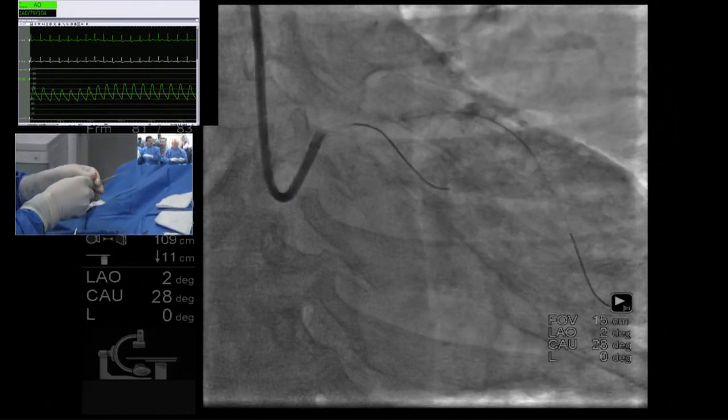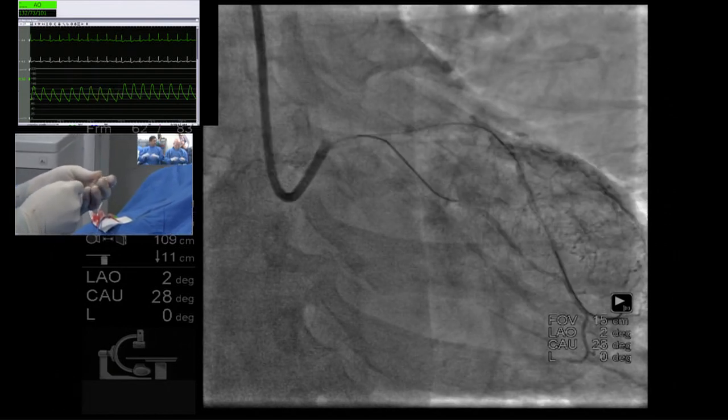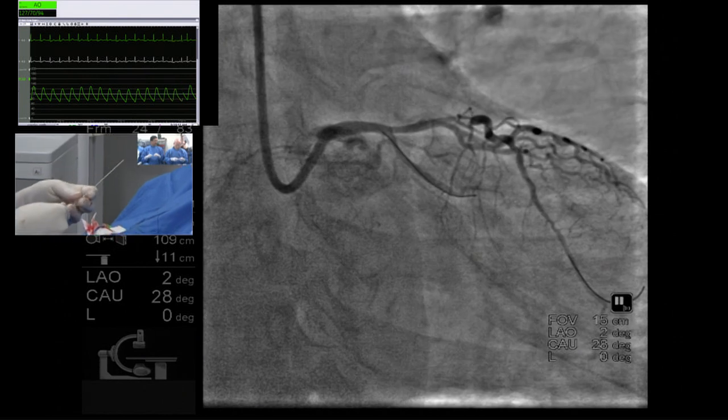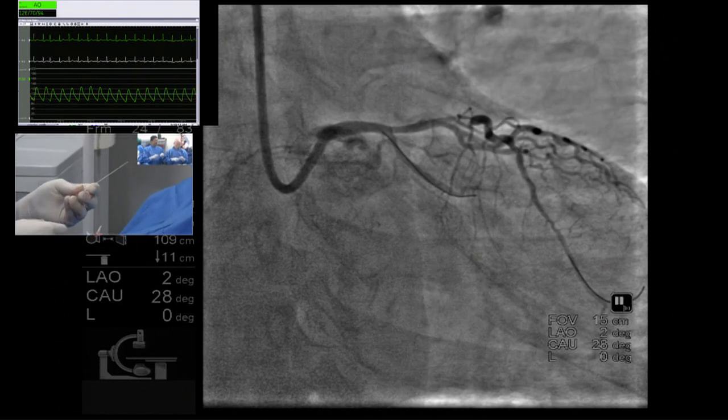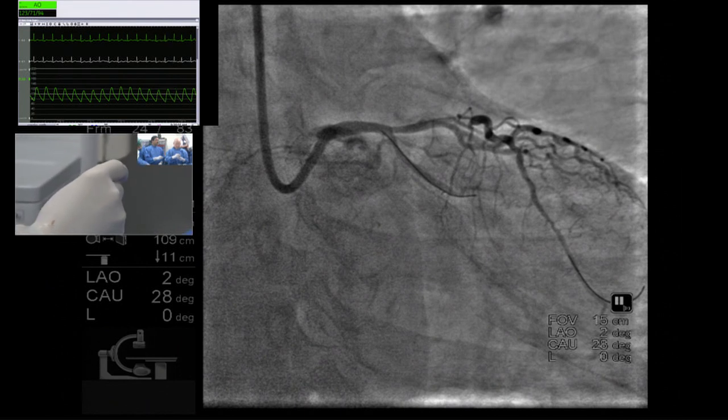In reality, you could probably look at the lesions in the first place, ask yourself that question, and then make more targeted toolbox choices by collecting more information and using that information to optimize your decision making. In the end, it comes down to trusting your fingers and what your fingers are telling you. So I'm wondering what the fingers of Dr. Saito are feeling at this moment.